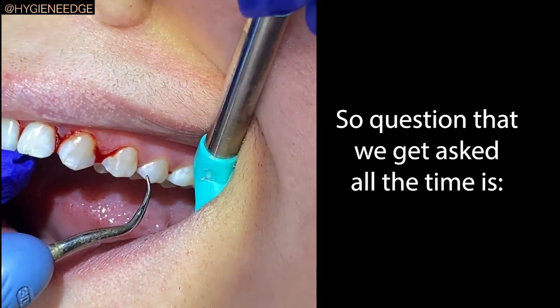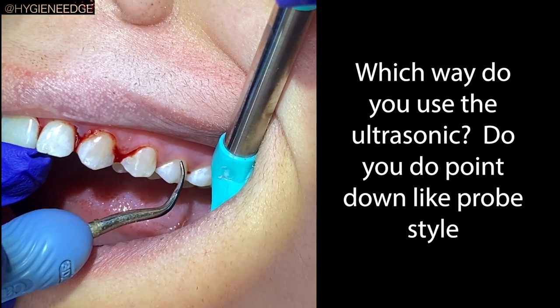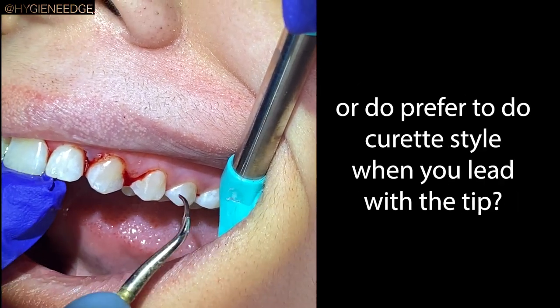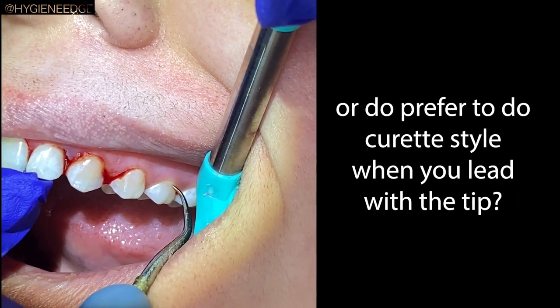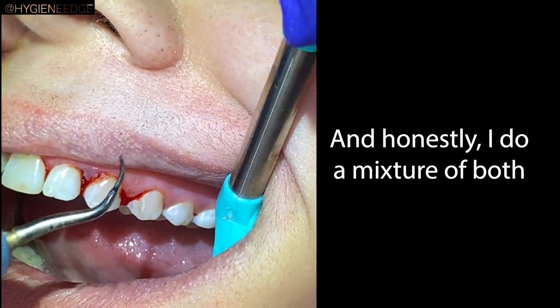A question students ask all the time is: which way do you use the ultrasonic? Do you do point down like probe style, or do you prefer curette style when you lead with the tip? Honestly, I do a mixture of both.